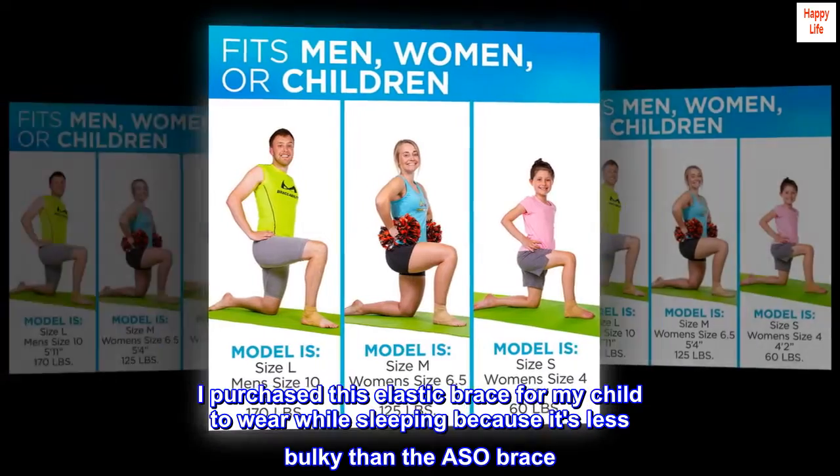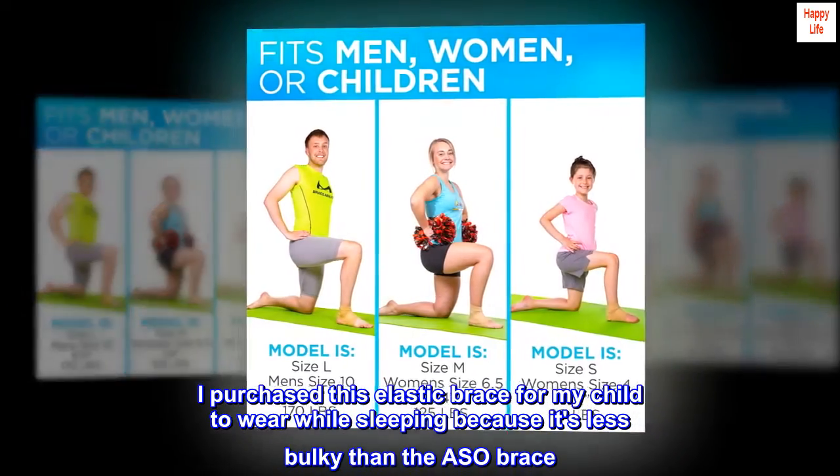I purchased this elastic brace for my child to wear while sleeping because it's less bulky than the ASO brace. It worked well for that purpose.